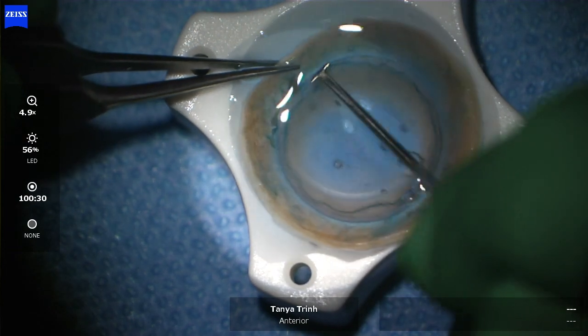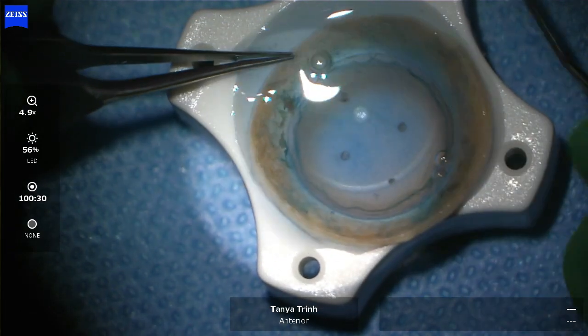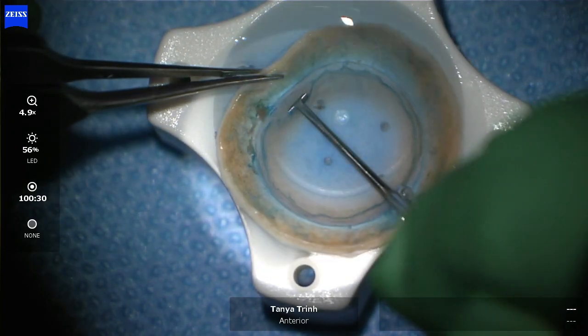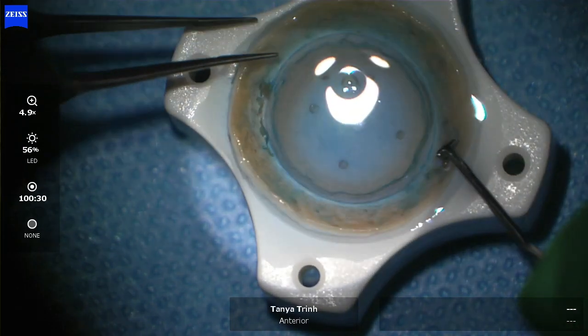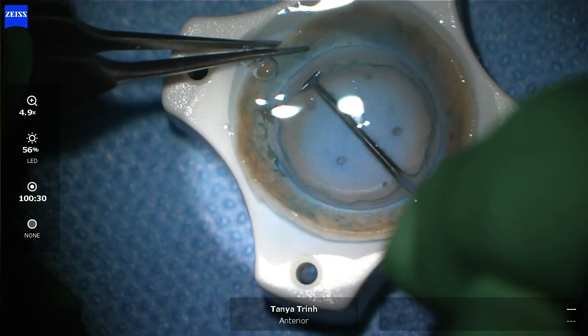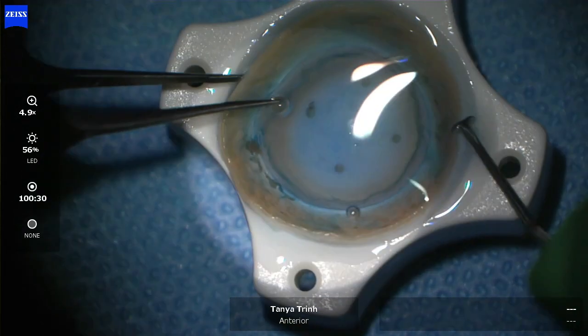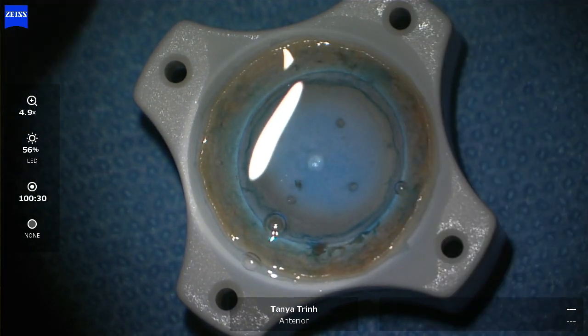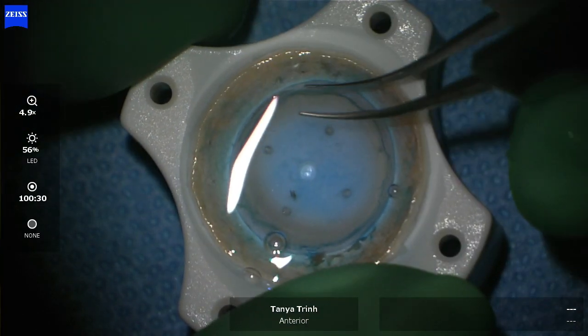I'm now coming up to the end of the 360-degree first round. I'm fairly confident in this instance that we've separated most of the tissue, as it's come away quite nicely. In most other circumstances, however, I will go around a second time just to check that my tissue is free of any adhesions.